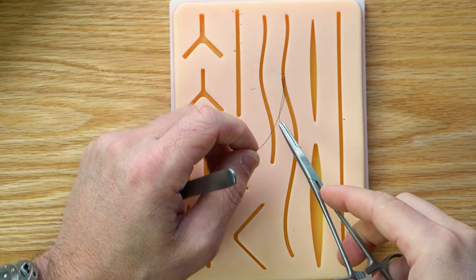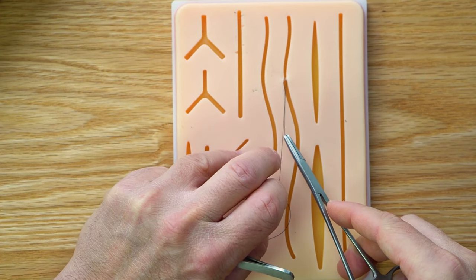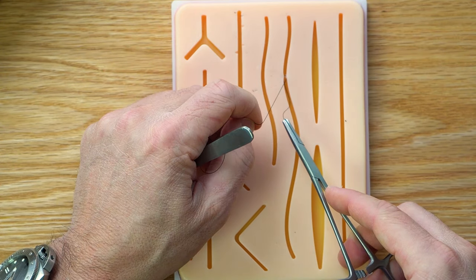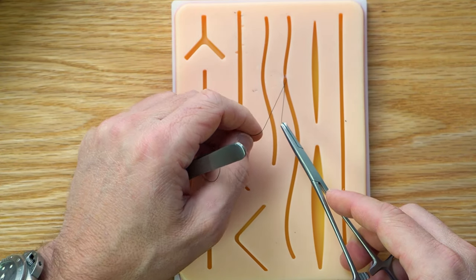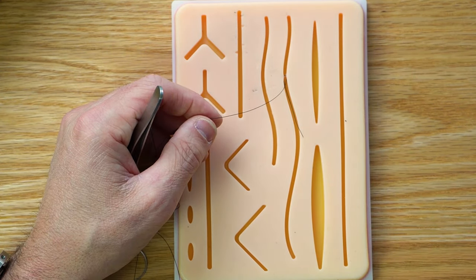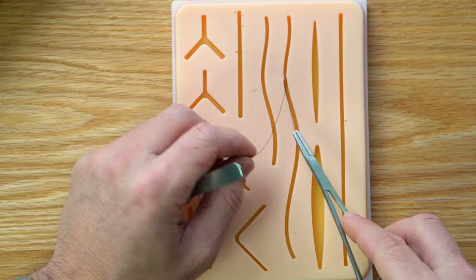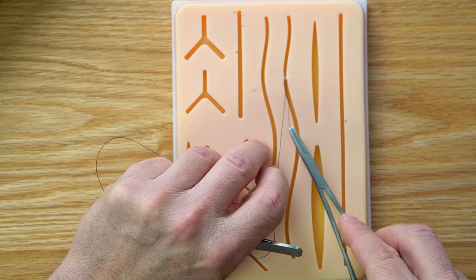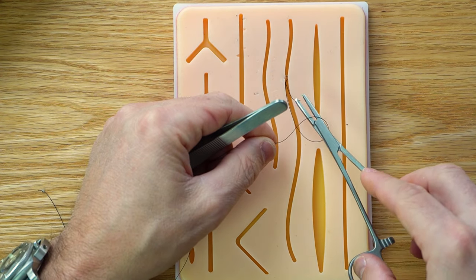So a lot of times I'll pull it like this, and I'll make sure that it comes together how I want it to come together. If it doesn't, I'll redo that stitch. I think a lot of students do this: I see them doing their knot, and I see it's not going to come together, and they tie the whole thing, and at the end it doesn't look good. So they're like, what did I do wrong? Well, first of all, you have the two sutures, one on the top and one on the bottom. And second, you did the whole thing. Just pull it tight, pull it together, and see if it's going to look like you want it to look, right? I'm just going to make a regular knot right here.